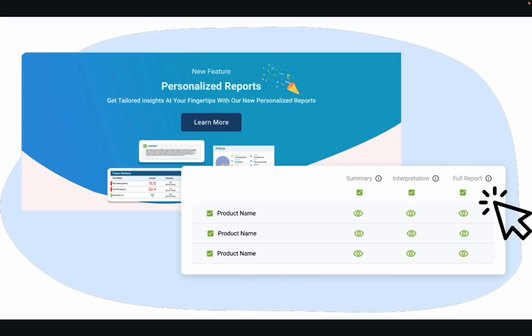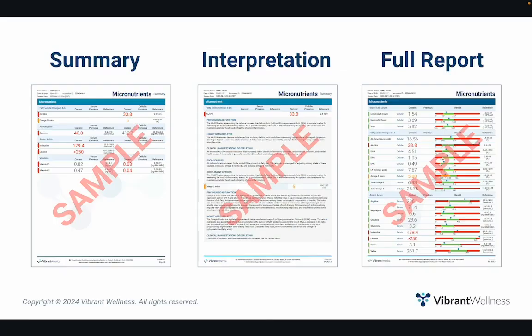Before we dive into the actual report, I want to remind you that you get to choose how much information to include in the report you download for yourself or share with your patients. You have three options: summary, summary with interpretation, and full report. I'll be going over the report that includes all three options combined, as it is the most comprehensive.